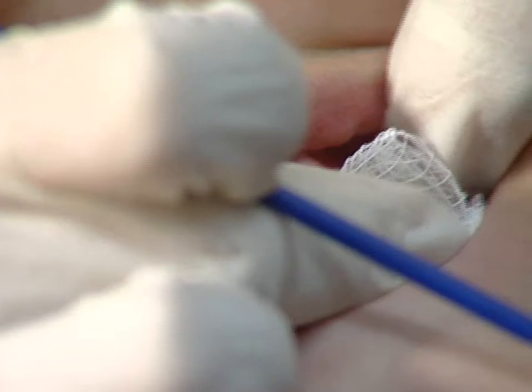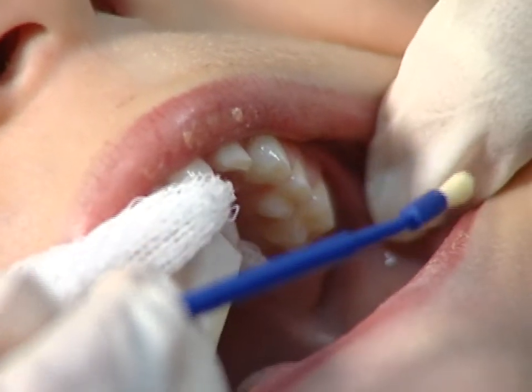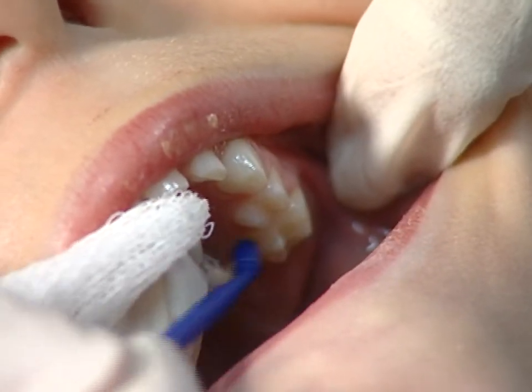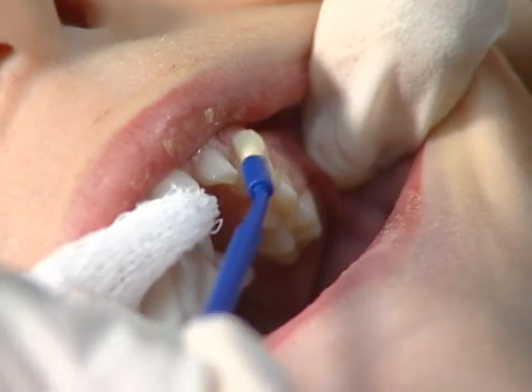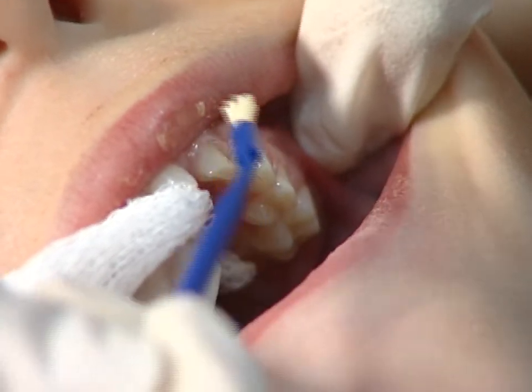Older children have more teeth and you will have to start by applying the fluoride varnish to the back teeth. Dry the teeth in the upper left corner of the mouth with the gauze and paint on the fluoride varnish. Be careful to hold the tongue and cheeks out of the way. In this case, we're using Enamel Pro varnish.